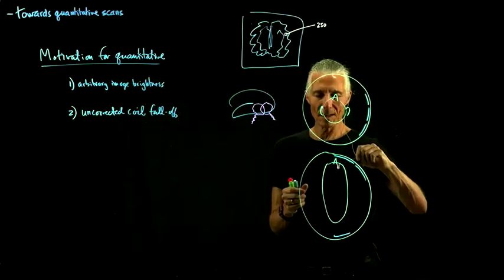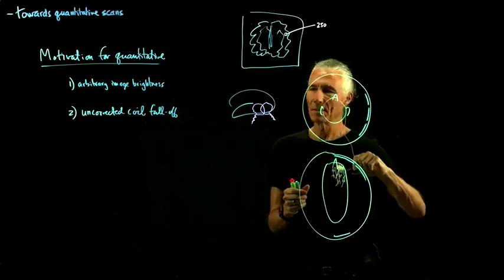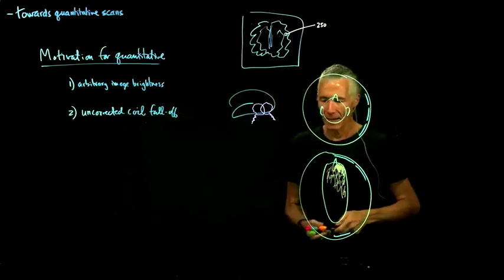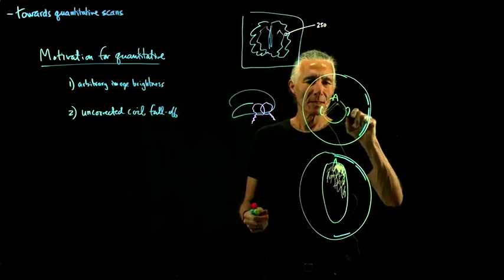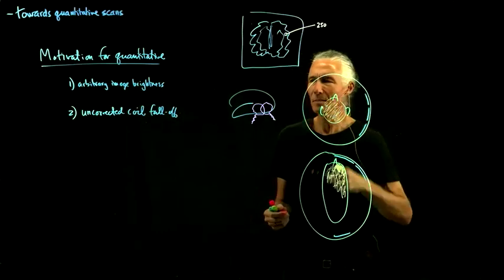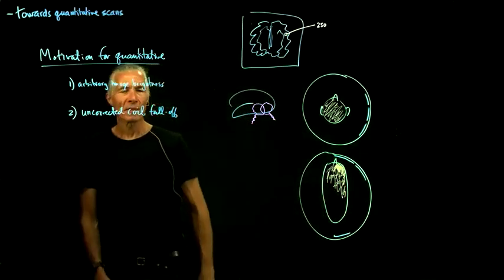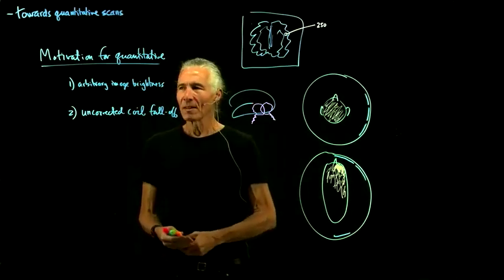It can be 2 or 3 times as bright because you're closer to that small coil, and so you'll get an image like that has this giant falloff in brightness. Whereas somebody else with a smaller brain that's more equally spaced from the coils will literally be like 1/2 or 1/3 as bright as the frontal lobe here. So that's a major problem, and we'll talk about several ways of fixing it.